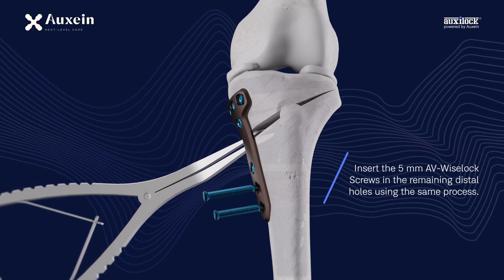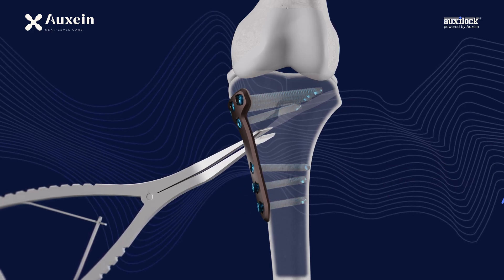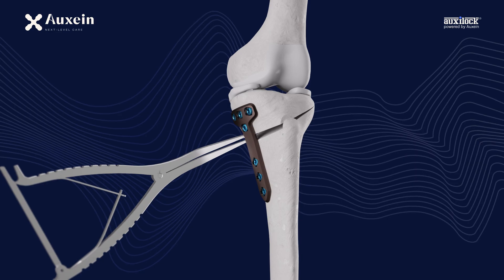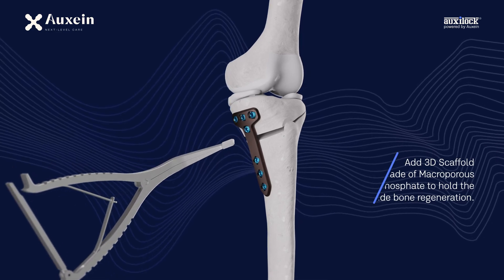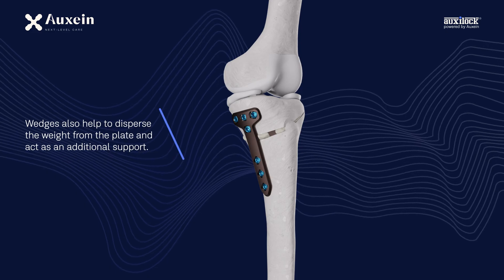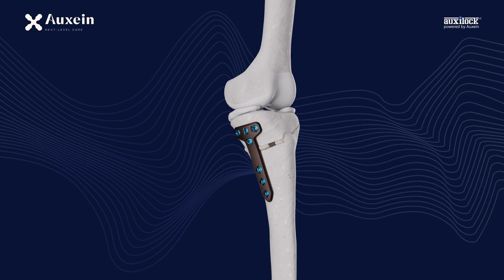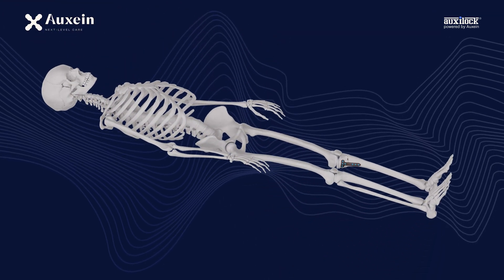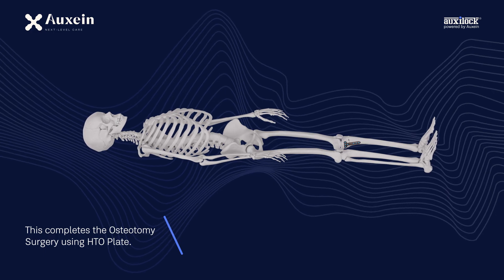Insert the 5 mm AV Wyselok screws in the remaining distal holes using the same process. Add 3D scaffold wedges made of macroporous calcium phosphate to hold the gap and guide bone regeneration. Wedges also help to disperse the weight from the plate and act as additional support. This completes the osteotomy surgery using the HTO plate.